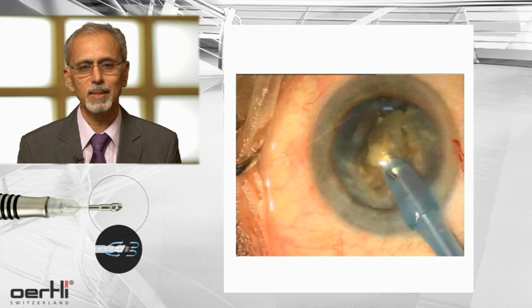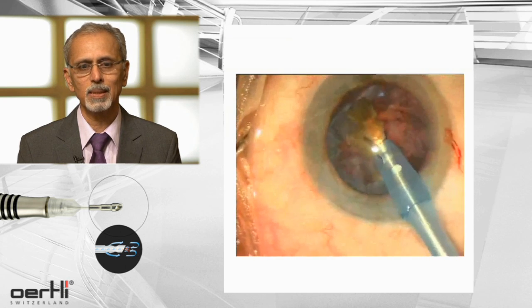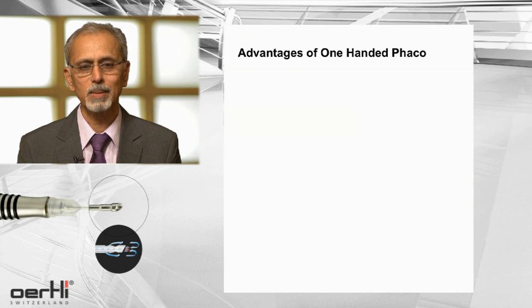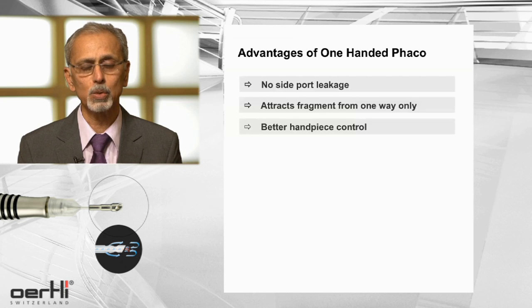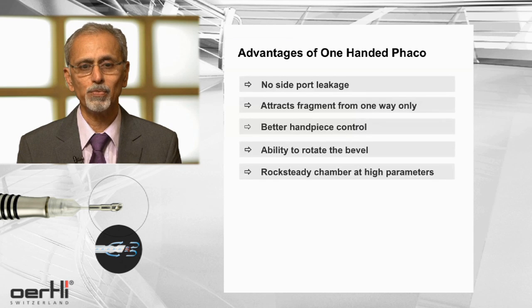There is excellent followability, the AC remains stable, and the fragments are aspirated magnetically. There are some advantages: there's no leakage from the side port; only one way for the fragments to be attracted and that is to the tip; there's better control over the handpiece; one can use the second hand to actually turn the side piece sideways; and there's ability to rotate the bevel to the side where the action is — with a rock-steady chamber at very high parameters.